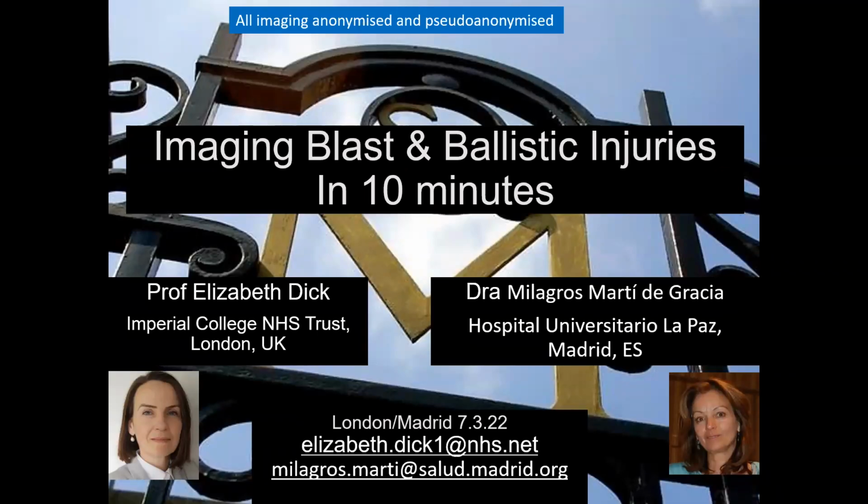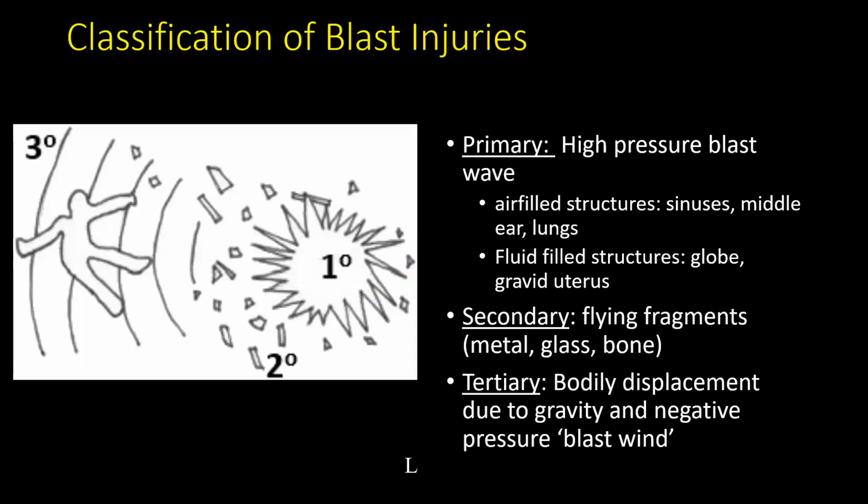In this 10-minute talk, you'll learn all that you need to know about the imaging of patients who have experienced blast injury and ballistic injury. So blast injuries are classified into three main categories, and we're going to go through these in turn.